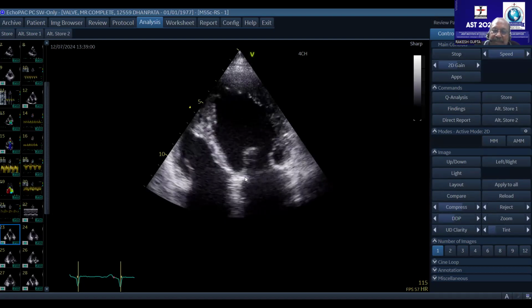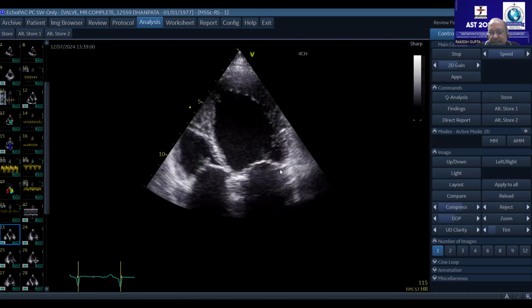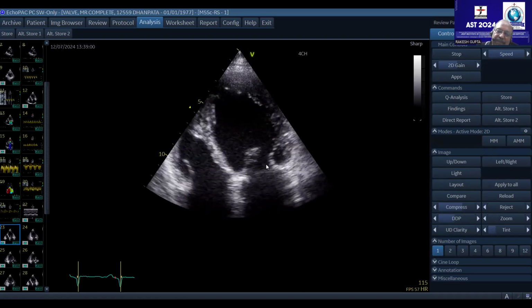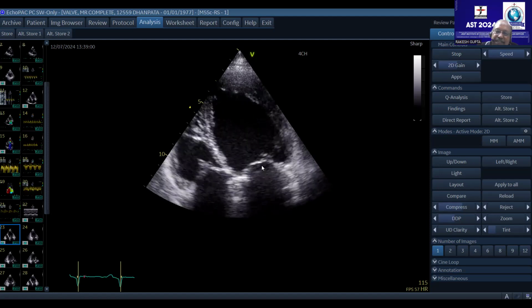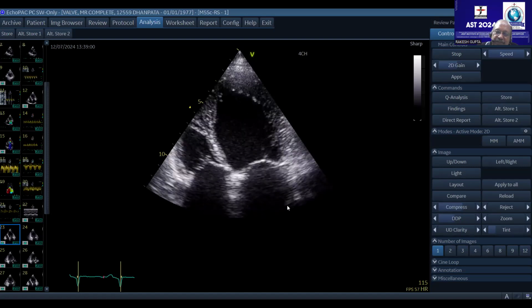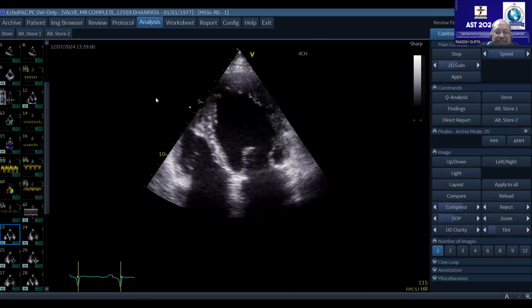By putting a line measuring the diameter of the mitral valve in 4-chamber. Diameter divided by 2, multiplied by pi r square, into VTI will give me the stroke volume of the mitral valve. Then we calculate the stroke volume at LVOT. Mitral valve stroke volume minus LVOT stroke volume is the regurgitant volume. No or yes? Yes. Yes. Little bit of yes.